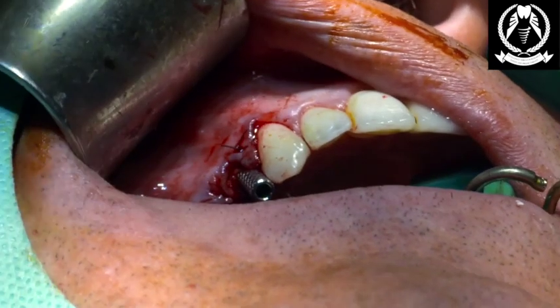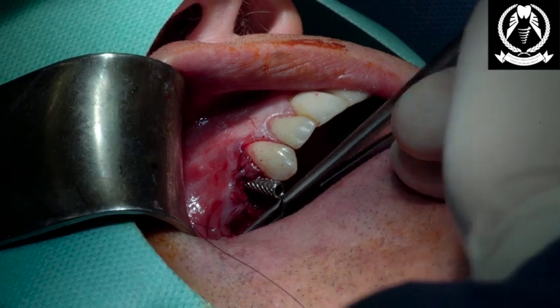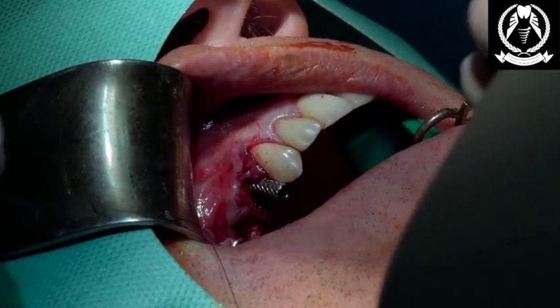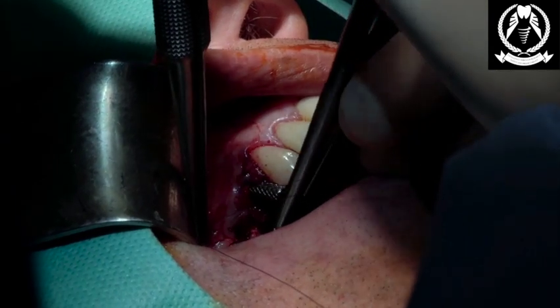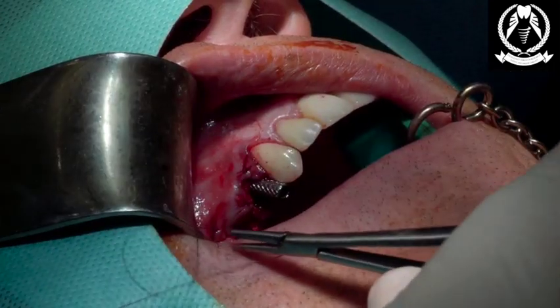So I'm going to go either side of that healing cap, Bianca, as a horizontal H. So we're doing a horizontal H. Just one continuous, just to take it around here. And you're going to get me some hemocollagen, please. Yes, Bianca? Hemocollagen. Let me pull that out. There we go. Beautiful. And then that's coming that way. Let me just tie that off, almost like a socket.